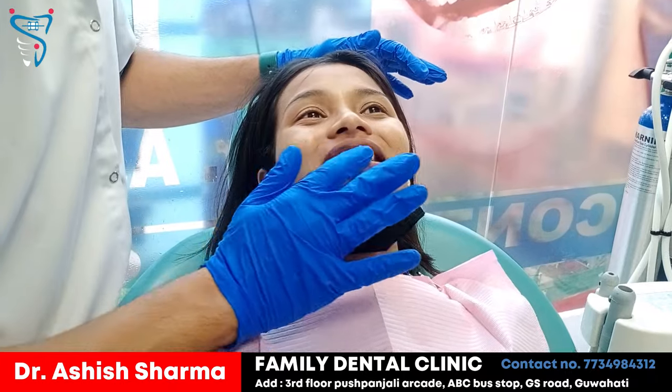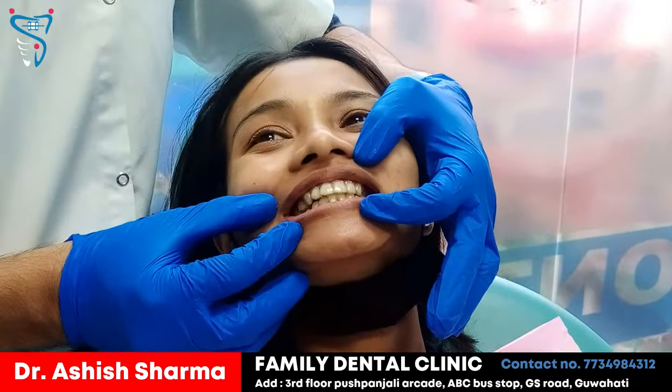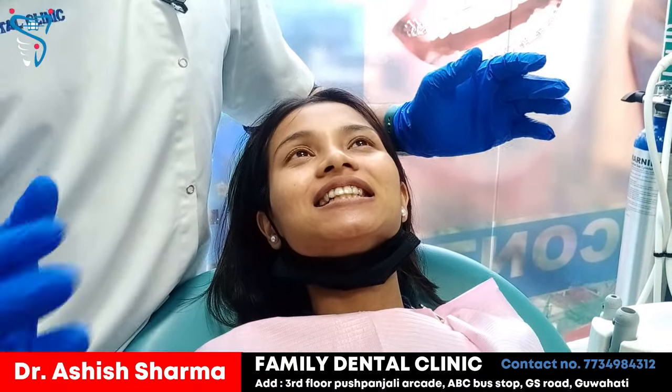This is placed here and you press it and it fits properly. The patient's bite is proper — you can check this. These are completely transparent. These retainers have to be worn 22 to 23 hours in a day.